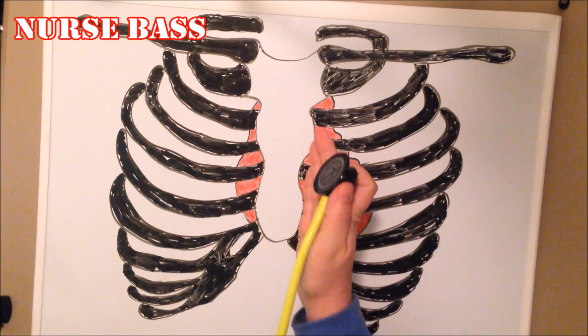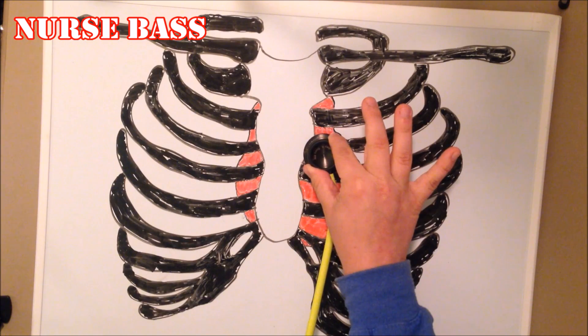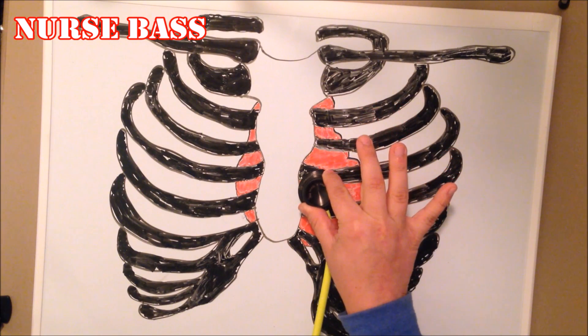The next point is the Tricuspid valve. It is the left sternal border, fourth intercostal space. So from Erb's point you simply go down again — left sternal border, fourth intercostal space.